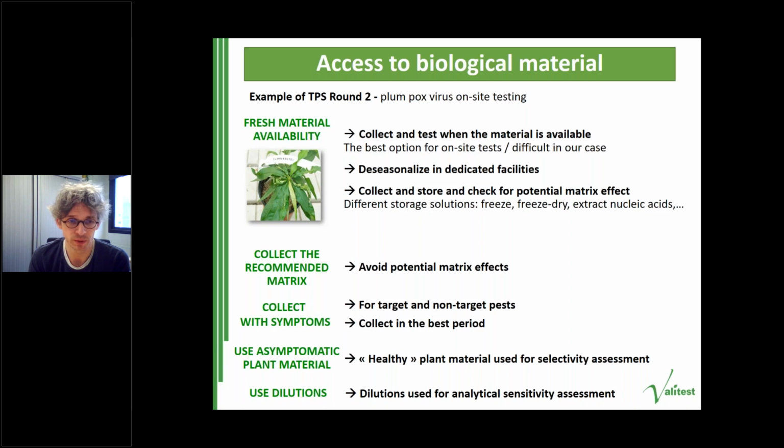We wanted to collect symptoms for target and non-target pests. And again, you want to do it at the best period. It is easier when you want to collect healthy material. This was not an issue. And same for the dilution. You just have to dilute some of your samples to evaluate the analytical sensitivity.